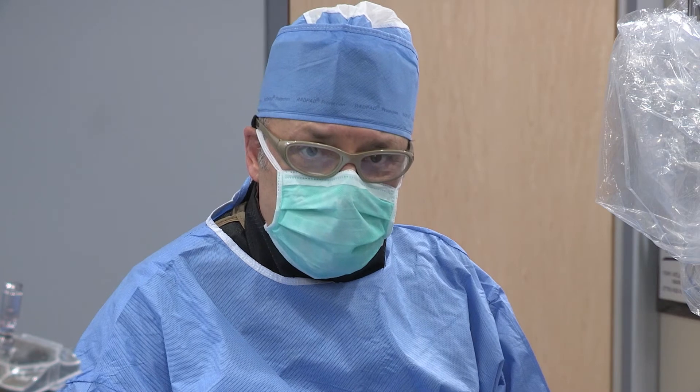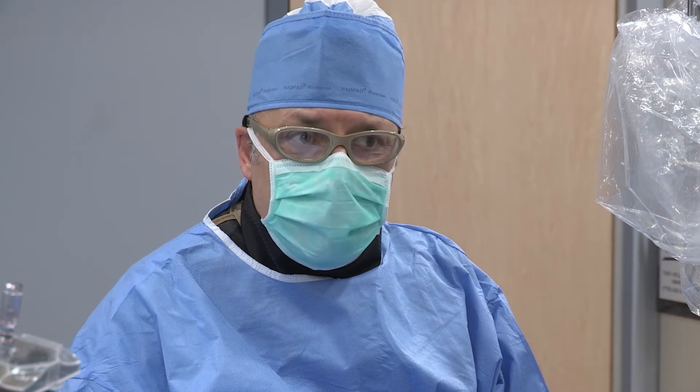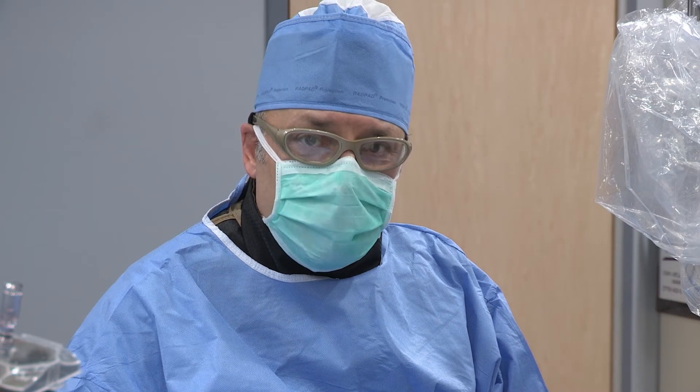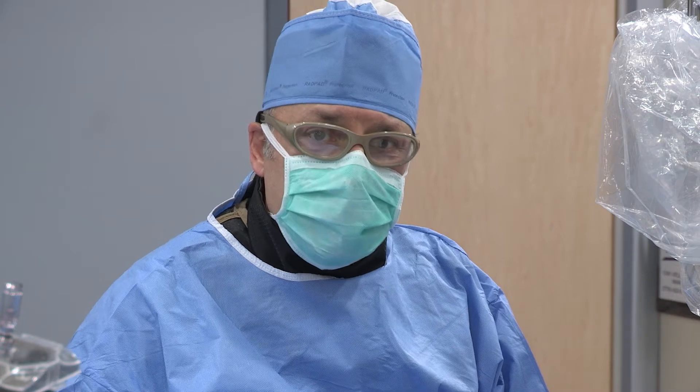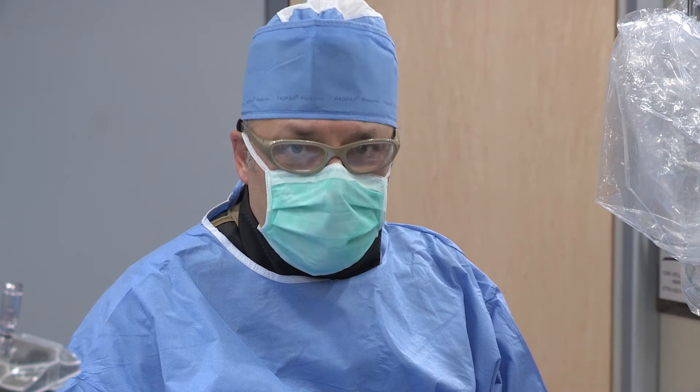This presentation is mostly to show how to utilize the Cardeva Vasquez closure device in closing the femoral artery. We firmly believe that to have a successful closure and successful placement of the closure device in the femoral artery, we need to understand how to place the sheath in the femoral artery.